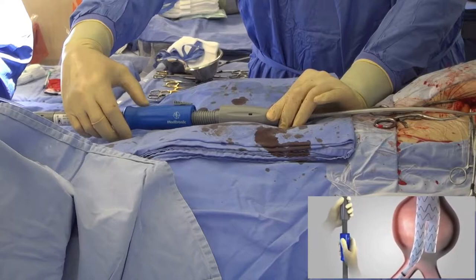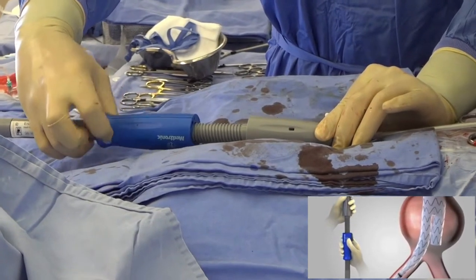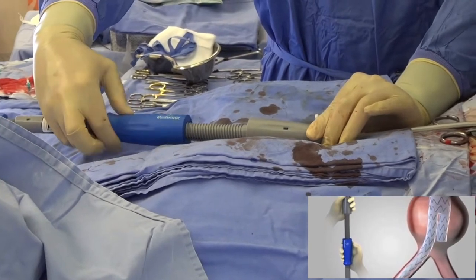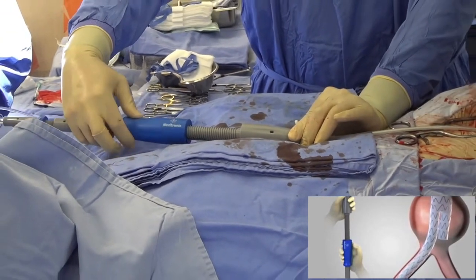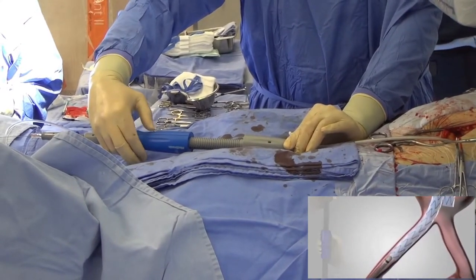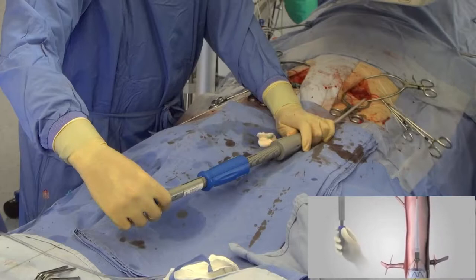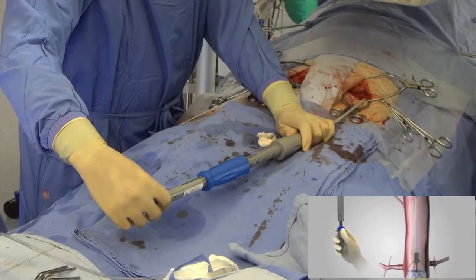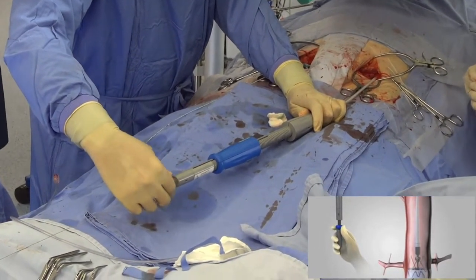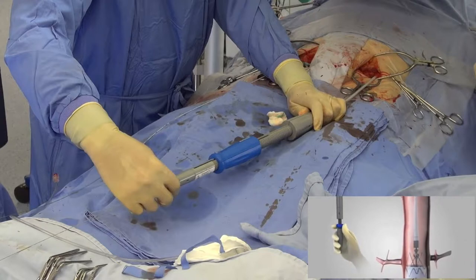Care is taken to avoid occluding the internal iliac arteries, which are the main blood supply to the pelvic region as well as the distal part of the bowel. The proximal nose cone is opened up to deploy the bare metal struts above the stent graft. In this case, the bare metal struts also contain talons that fix the stent graft in position to avoid distal migration.